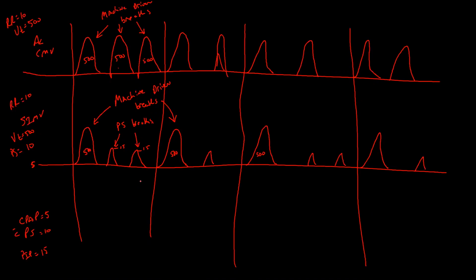So how would you know if you're in a SIMV mode that the patient needs pressure support? Because you're going to look at the return tidal volume from those breaths, and you'll adjust your pressure support to get a tidal volume that's acceptable for you, whether it's 6 cc's per kilogram or whatnot.